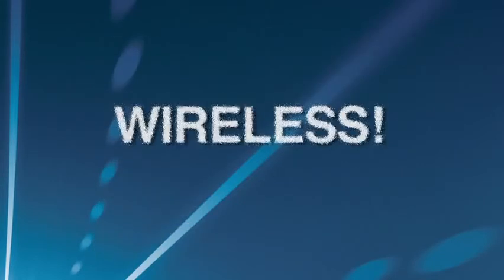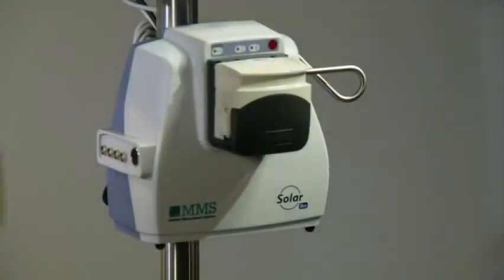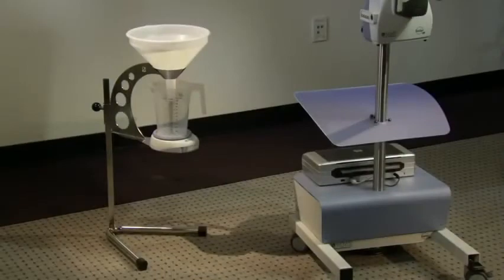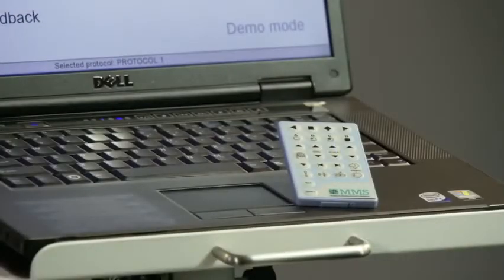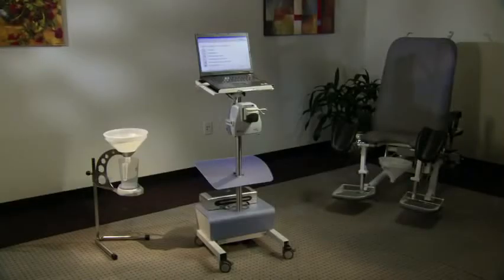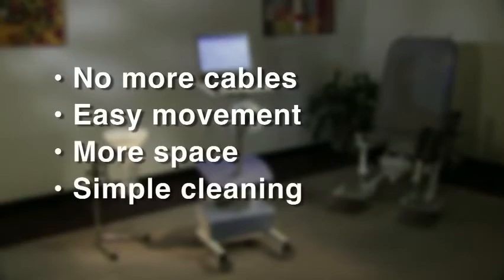The SolarBlue is 100% wireless — wireless between the SolarBlue module and flow meter, UPP puller, remote control, and computer. In addition, the SolarBlue module is able to run on rechargeable batteries. The result: no more cables, easy movement, more space, and simple cleaning.